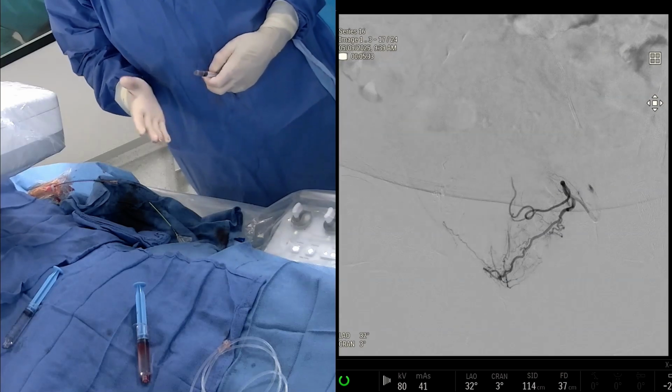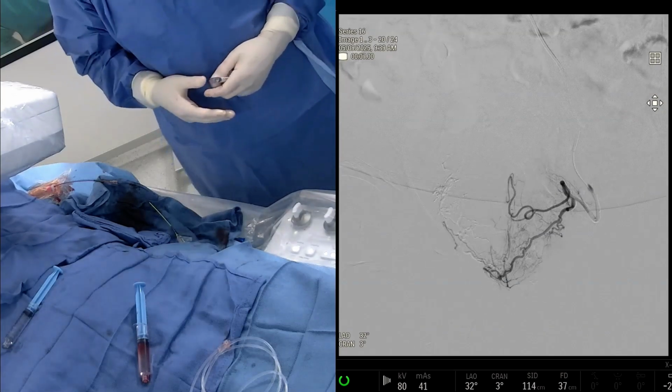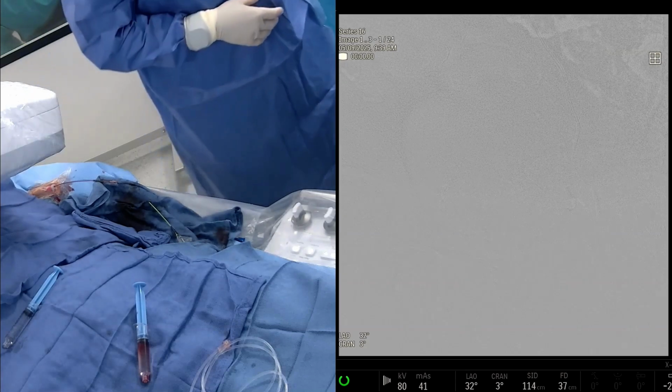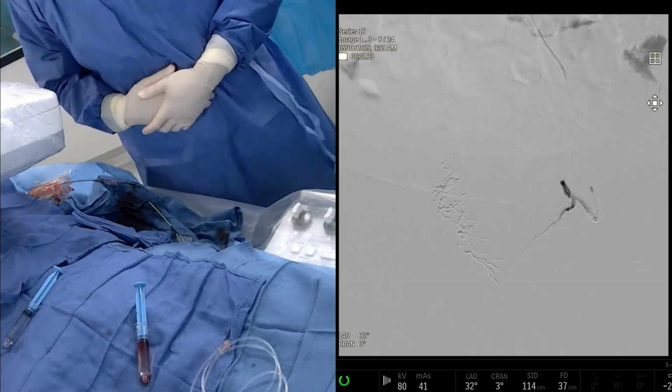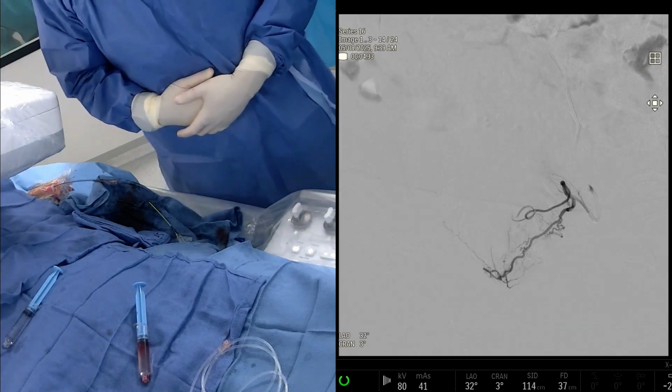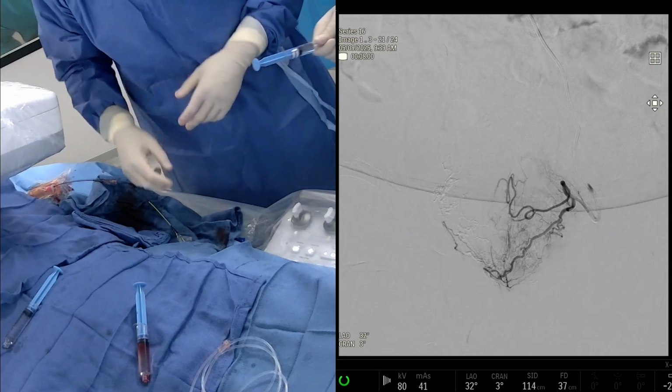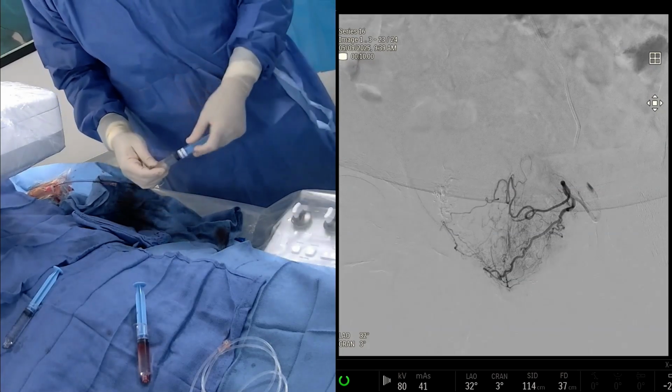One of the things that we're looking for on that bottom branch is whether there's branches exiting the prostate and going to the penis, which we sometimes see. Before we put the balloon up, since we have the sniper, we're going to put some more nitro in just to make sure that we give ourselves the best possible chance to get as distal as possible. What would you guys do here?